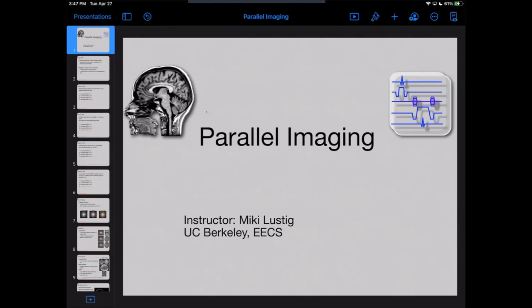But something happened about 20 years ago where people realized that you could actually image with multiple receivers at the same time and digitize them. There are huge advantages to doing that, in signal to noise ratio, but also in imaging speed. To be honest, one of the major revolutions of MR in the last 20 years was this, because it very quickly proliferated and many vendors started implementing those techniques. Basically every time you get scanned now, you're using this technology, which is called parallel imaging.